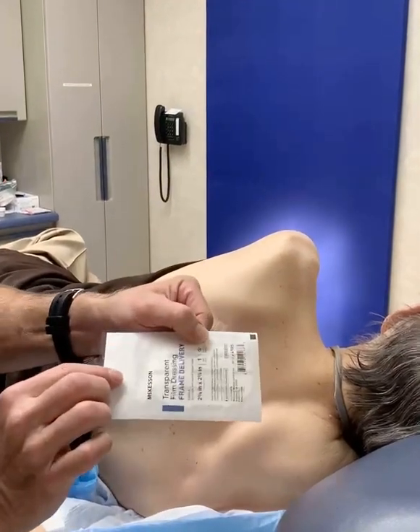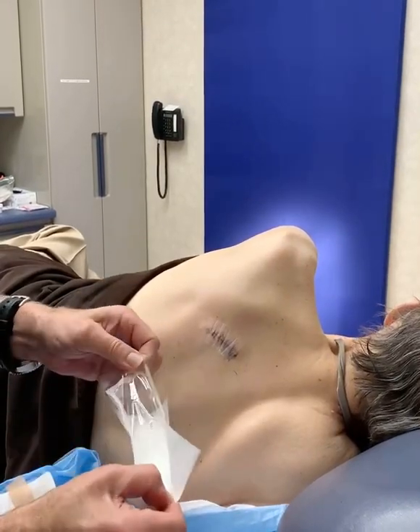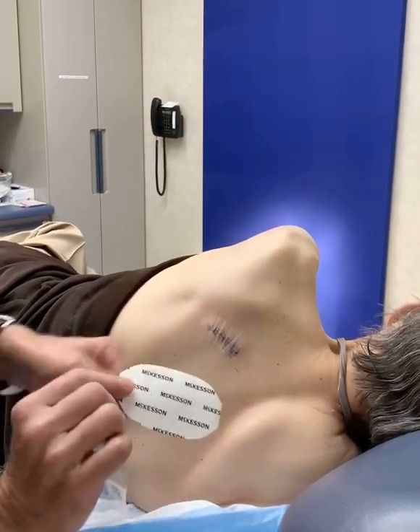This is the bio-occlusive dressing called transparent film. You're gonna peel it open. It has three layers.